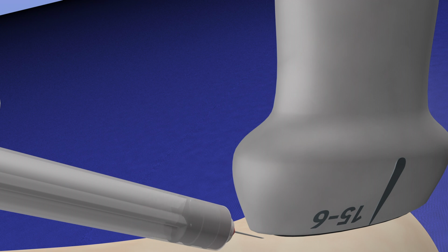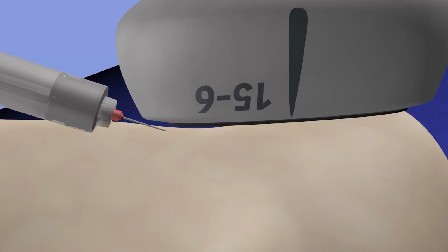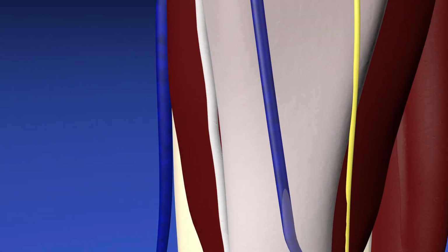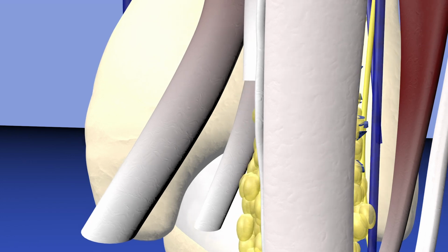Now we're starting the platelet-rich plasma injection, and we basically are just injecting the distal part of this Achilles tendon that has this calcification and partial tear. And here you can see a close-up view of the needle relative to the probe. So here we are looking at the lower extremity. We can see the small saphenous vein going distally, and also the Achilles tendon. See the Kager's fat pad underneath that.